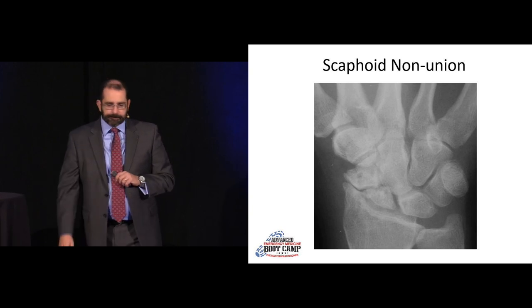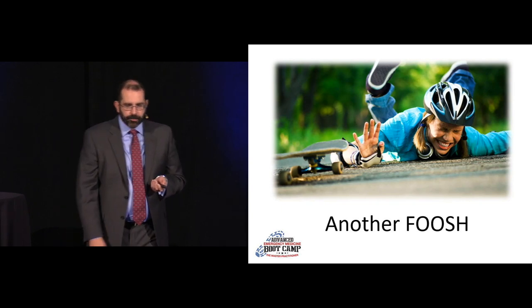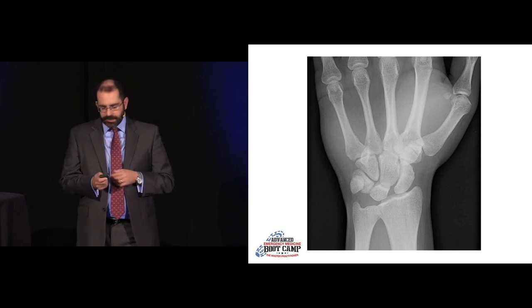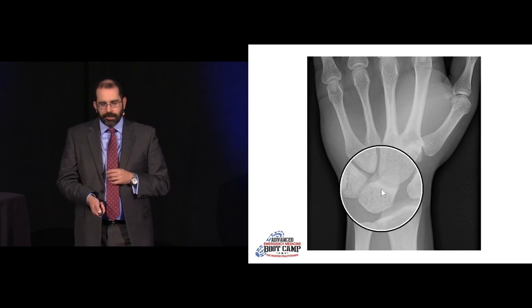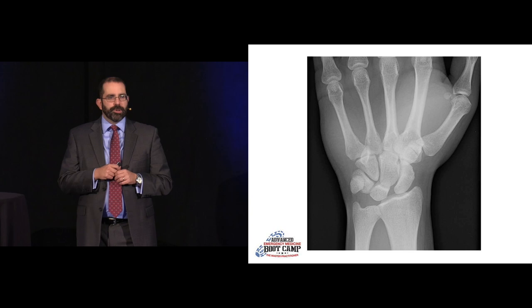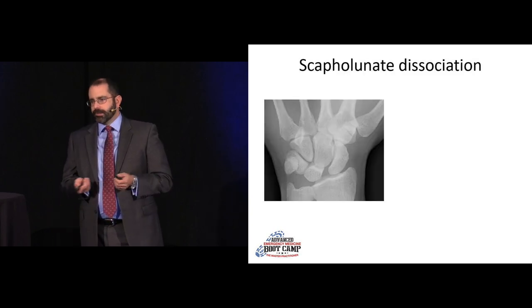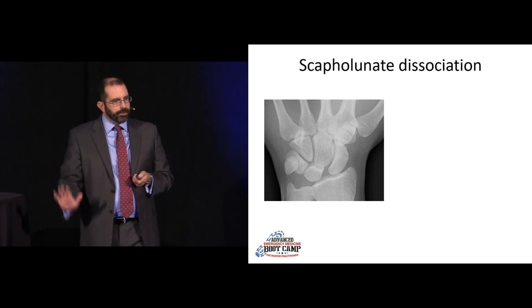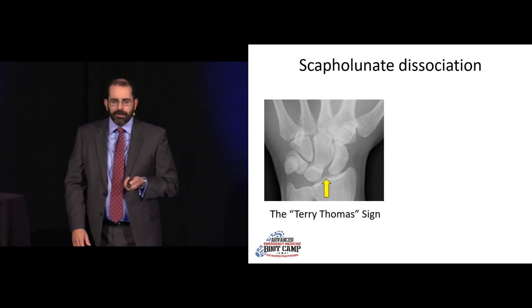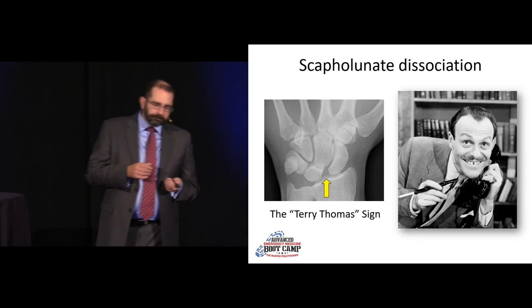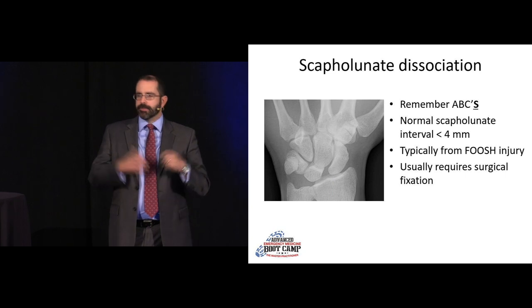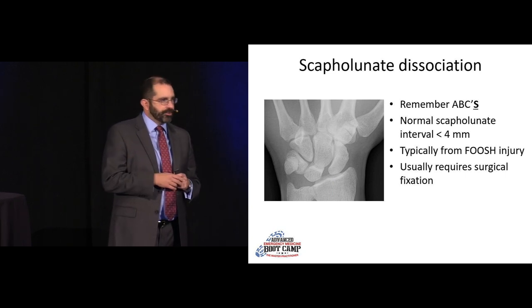Here's another FOOSH with wrist pain. The AP film looks pretty good, but when we look at alignment and spacing, something seems off. The articulation between the lunate and the scaphoid is much wider than the other intercarpal distances — like two to three times the size. This is known as scapholunate dissociation, classically occurring with a FOOSH mechanism. It's a disruption of the scapholunate ligament, called the Terry Thomas sign or Dave Letterman sign, for the gap between their teeth.